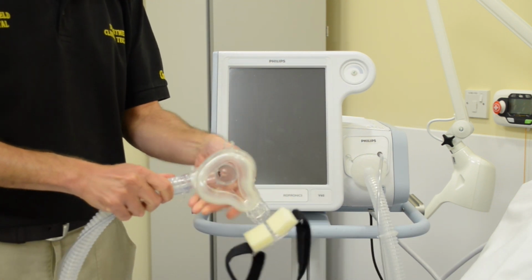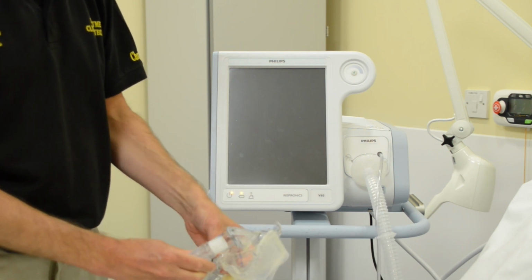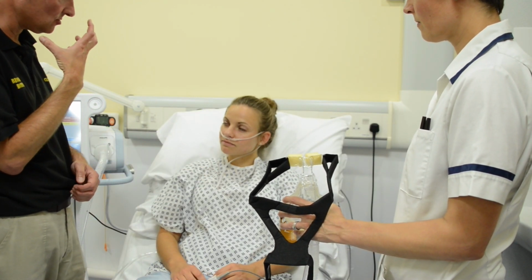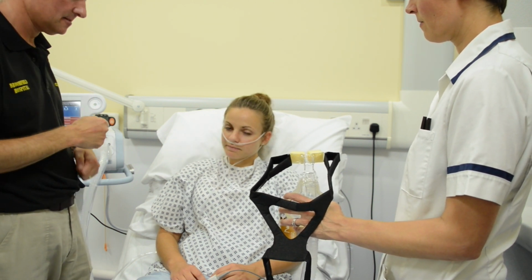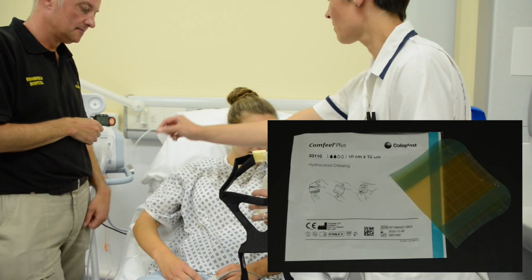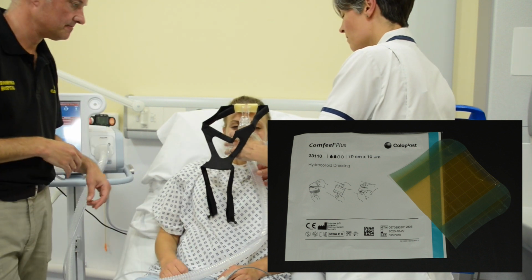Having already sized and obtained the appropriate mask for your patient, attach to the circuit and introduce to your patient's face with continual explanation and reassurance. If using an oronasal mask, consider applying a protective strip of hydrocolloid dressing to the bridge of the nose.